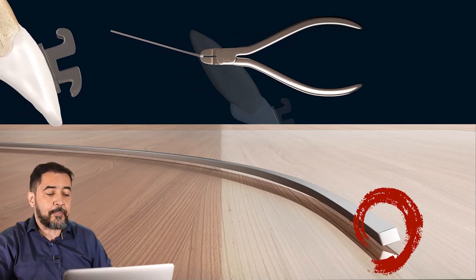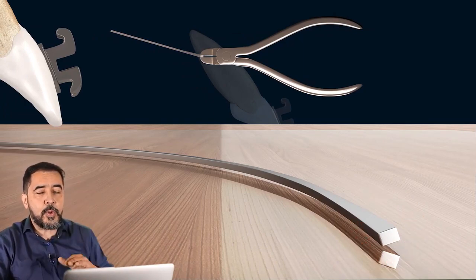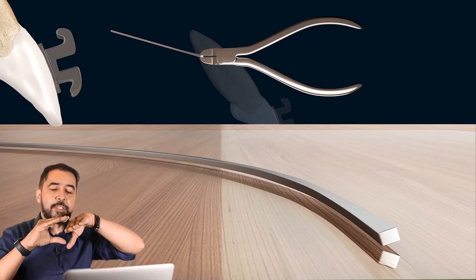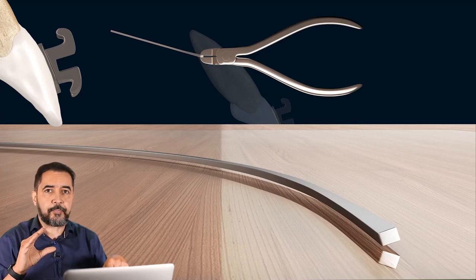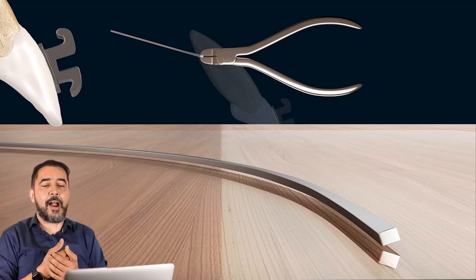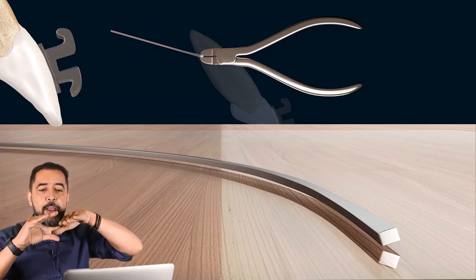What do we have to do? What if we do a torsion in our arch wire which resembles the inclination of the bracket slots in the anterior segment of our dental arch? What if I generate this torsion?